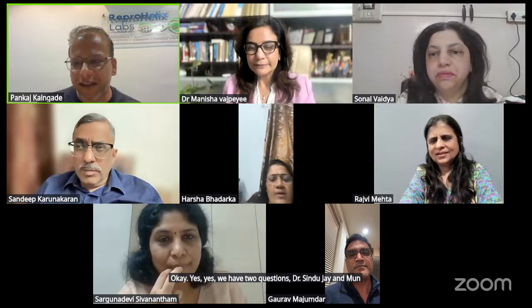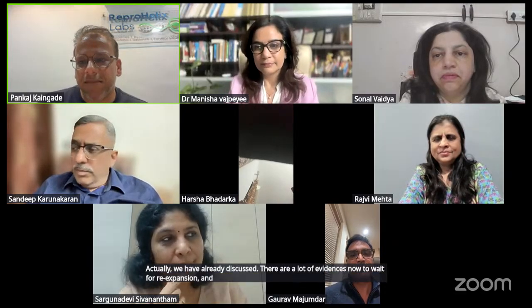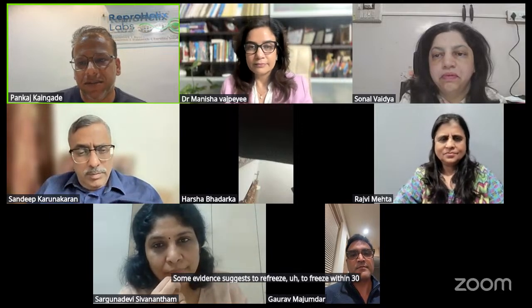We have 2 questions clubbed, from Dr. Sindhuja and Mrunal, but they have the same type of question. Actually, we have already discussed. There are a lot of evidences now to wait for re-expansion, and if it is an expanded blastocyst, even after biopsy, some evidence suggests to freeze within 30 minutes before re-expansion. What is your opinion on that?